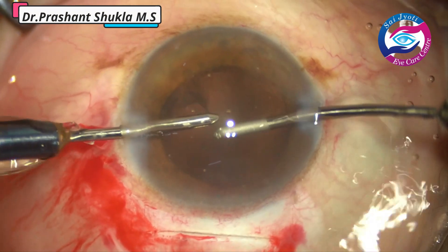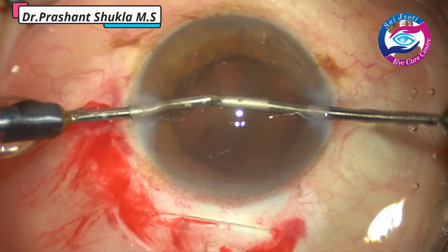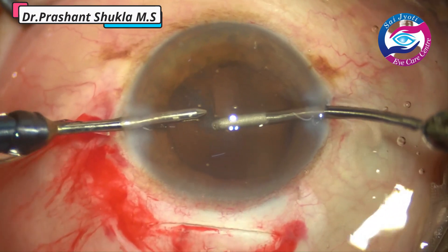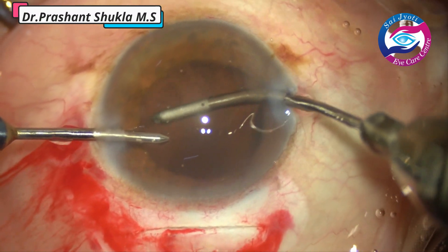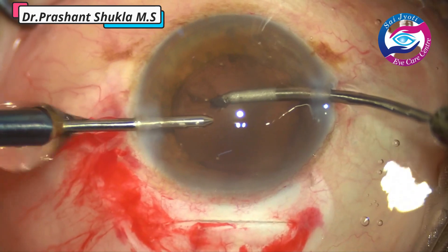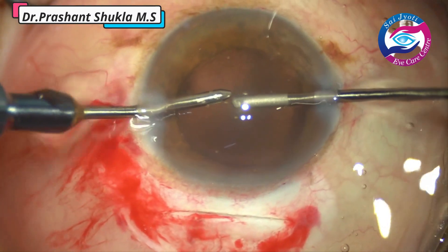Bi-manual irrigation aspiration is a very good tool to remove the sub-incisional cortex as well, because you can always switch hands and remove the cortex with great ease without the risk of chamber collapsing or any chances of catching the posterior capsule. We usually hold the anterior lip of the cortex, not the posterior lip.